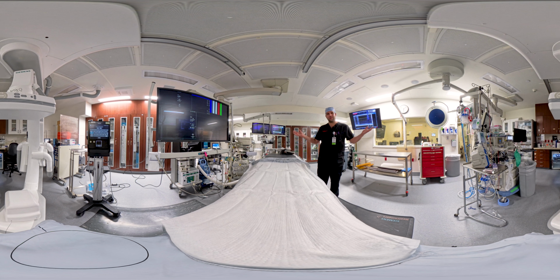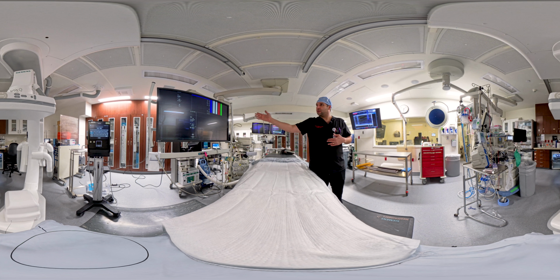This is the EP lab, or the electrophysiology lab, and this is where we do our ablations. You're currently on the bed that you will be staying on during the whole procedure. As you can see, we have multiple monitors around the room and multiple pieces of equipment to help me do this procedure. To your left, this is the main monitor that I use to perform the procedure.